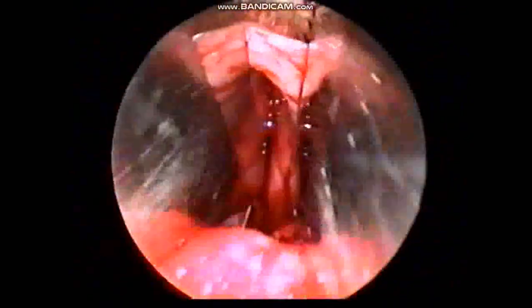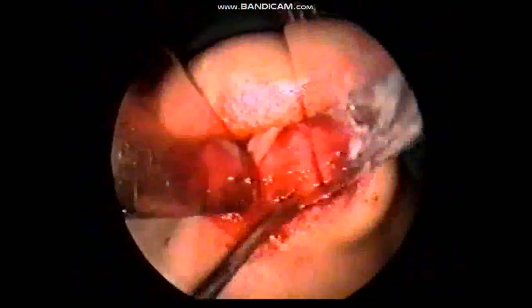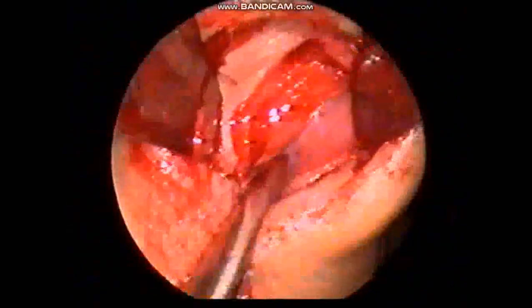You must come to the cartilage proper and lift the mucoperichondrial flap on one side. There you can see the flap being elevated completely from anterior to posterior, from the floor to the roof, and there is hardly any bleeding. Similarly the flap is elevated on the opposite side, but here the flap is not elevated to the dorsum as it is done on the other side. This is to see that there is adequate blood supply to the cartilage on the other side. There you can see the cartilage being elevated on the opposite side.